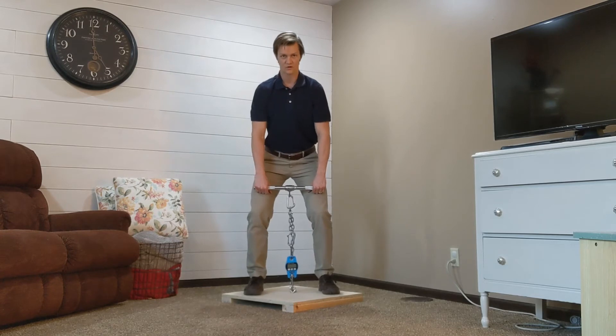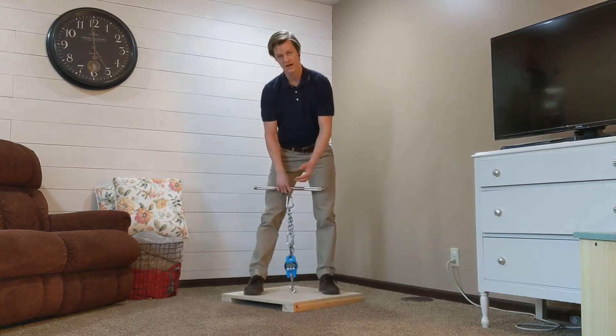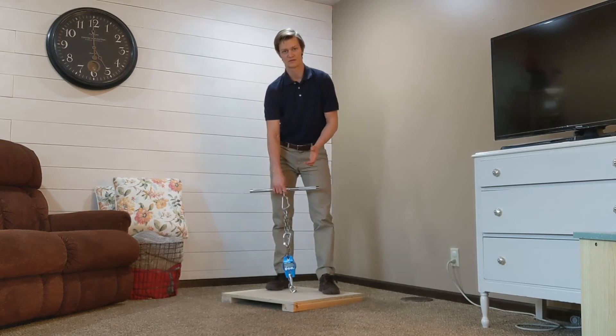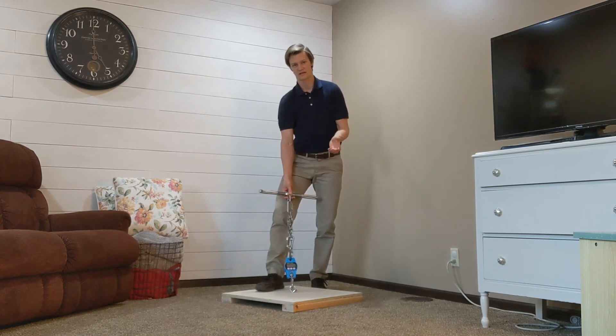For the mid-thigh pull, you're in a slight squat, athletic position. Then you have the patient pull up like so. While they're doing that, you have to watch the highest recorded number that they get. It's measured in pounds, kilograms, and newtons. The scale does not record the value, so you do have to watch it as they do it.